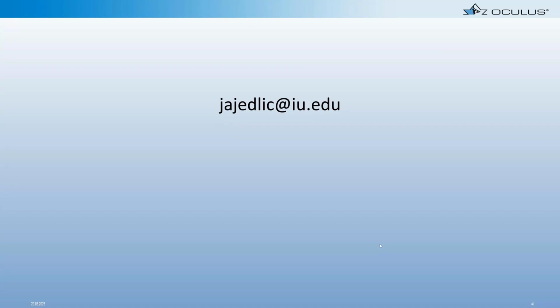Pentacam has significantly helped our clinic to deliver better outcomes with a more straightforward approach to better candidates and to find those patients who are not necessarily good candidates before we begin the process.